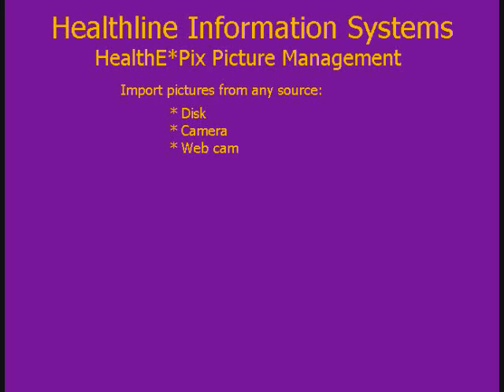Using a webcam is particularly useful in the healthcare environment because it means you never store the pictures for more than a few seconds on any PC, and they are deleted immediately afterward. This eliminates the possibility of the photos being seen by unauthorized individuals.